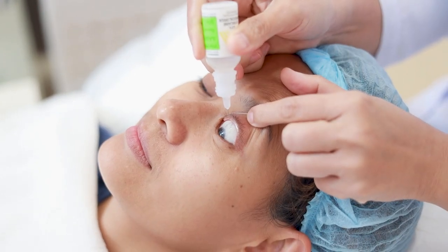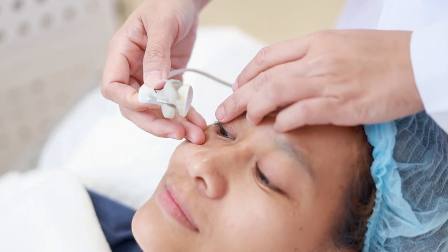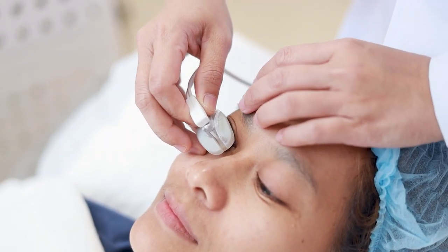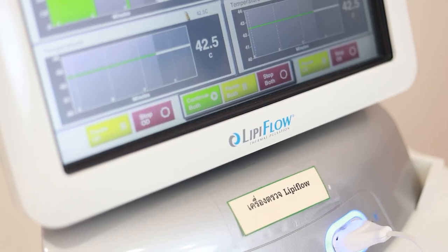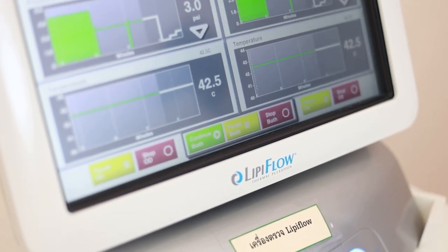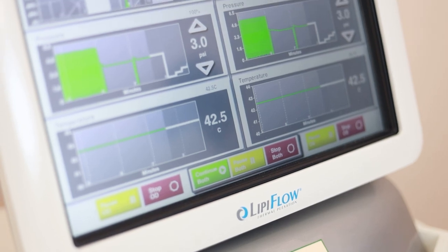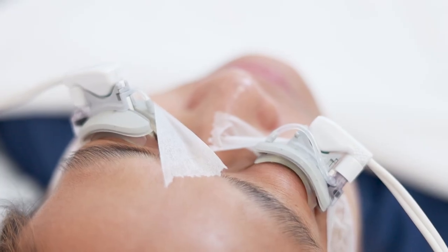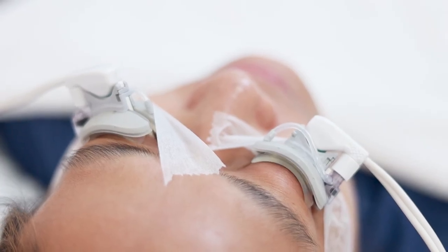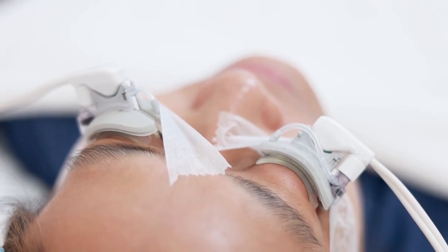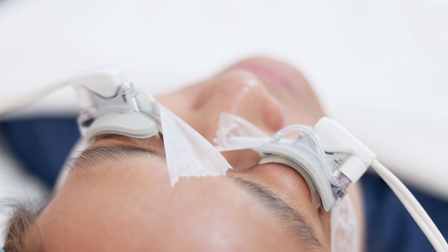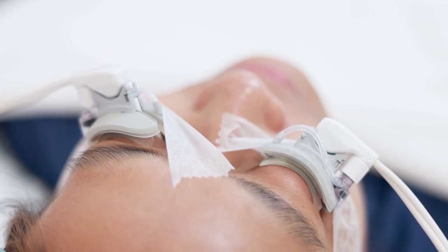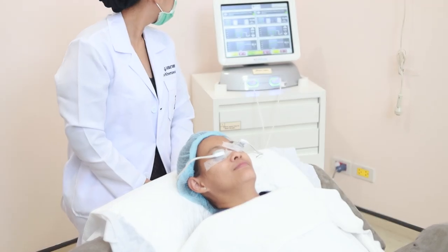The LipiFlow is the machine we use. We start the procedure by making a good clean to the eyelid. We use anesthetic eye drops for the patient and insert the instrument between the eyelid. The patient can close the eye throughout the procedure.